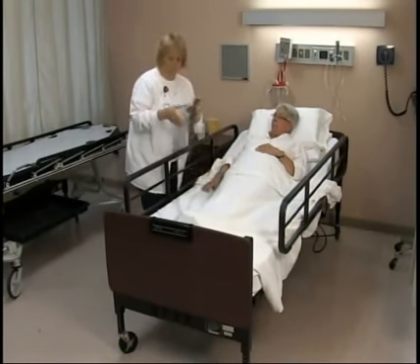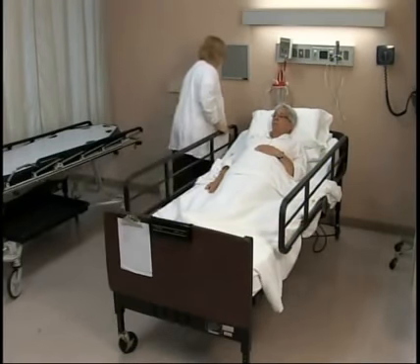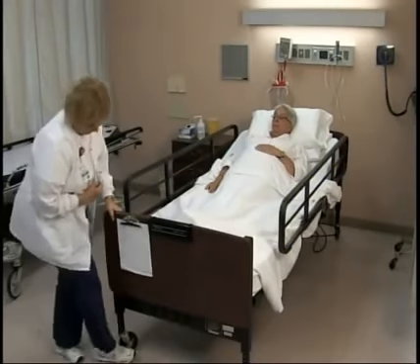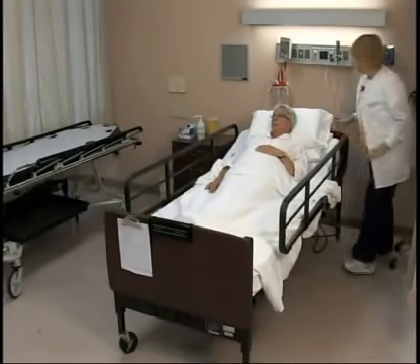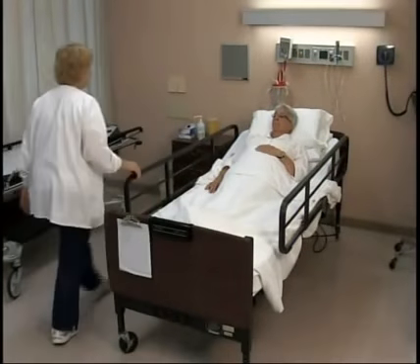Follow all safety practices. Make sure that the wheels on the bed are all locked. This ensures that the bed will not roll away when you are performing the transfer.